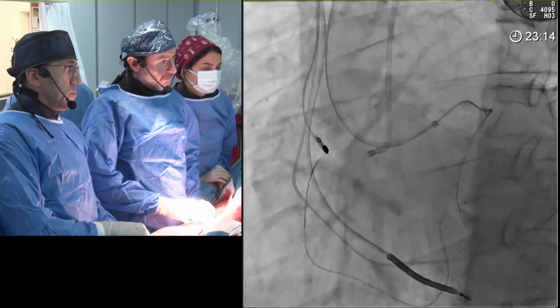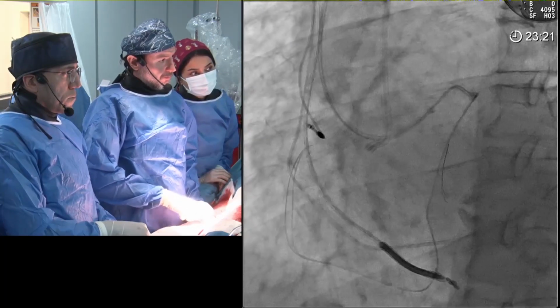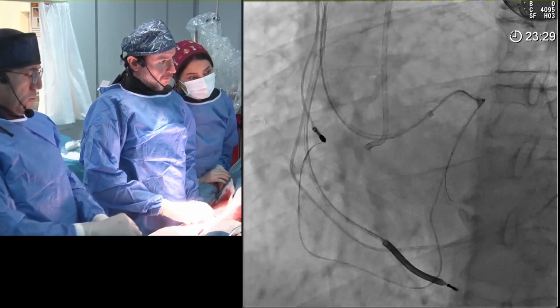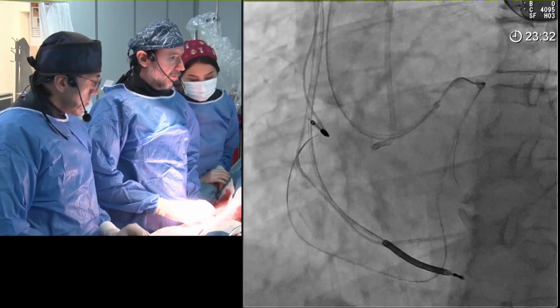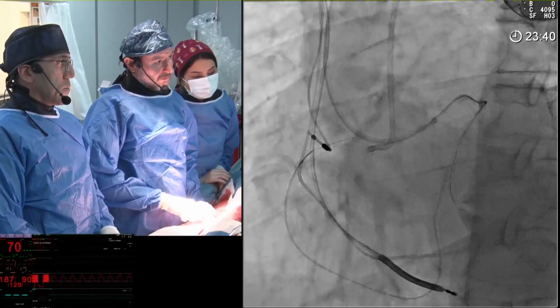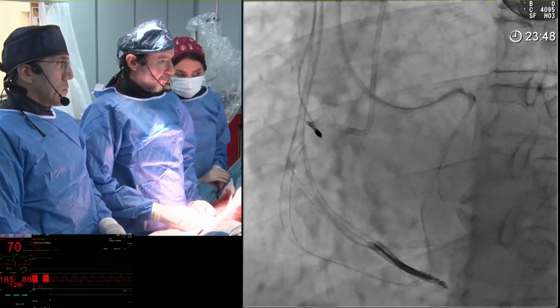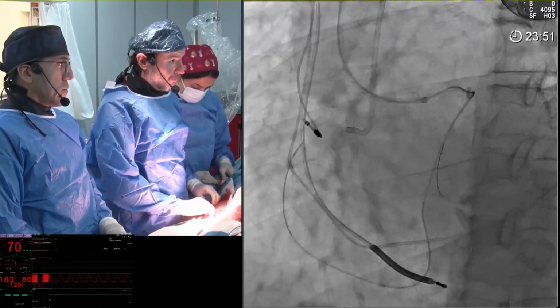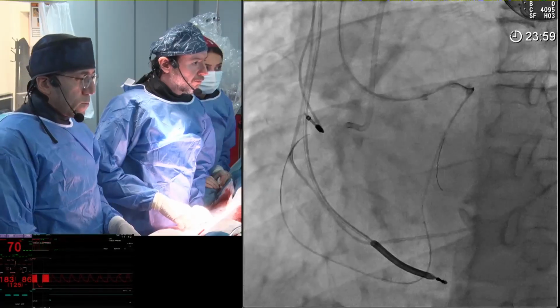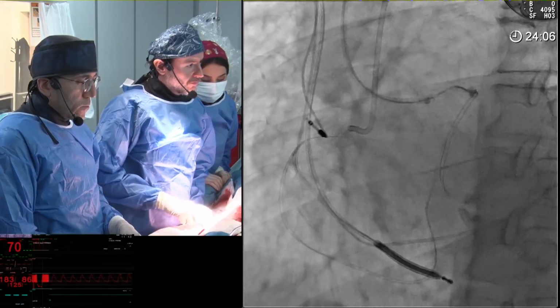That's one principle. Second, here he knows for sure there is vessel structure proximally. I would definitely do an injection there, because maybe you have a channel and you want to discover what's going on. And if it starts a dissection, then you push, make a dissection, and go in there. Then you put more contrast, so you define where you need to play, because here you don't know. You want to make sure that you have a vessel structure there. And then from there you can use a stiffer wire. Because at this point, you can exit the vessel structure, because you don't know where the vessel is. And the only way to know it here is with a knuckle or with an injection. Because the antegrade, they have to bail out of this and go femoral and get an 8 French there, because that's unlikely to work this way.